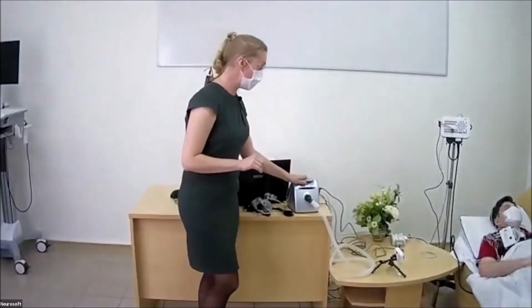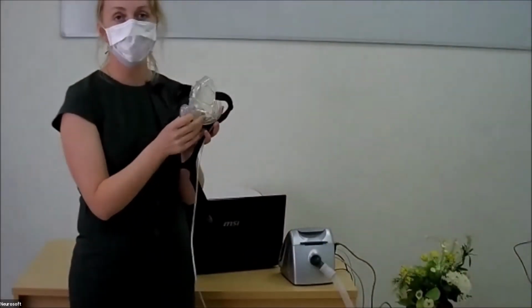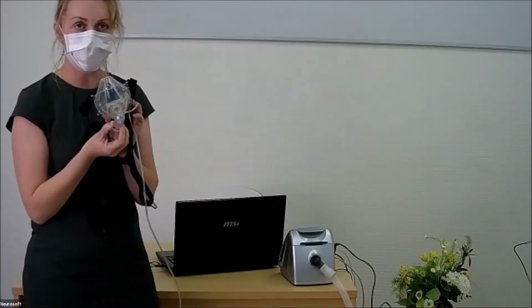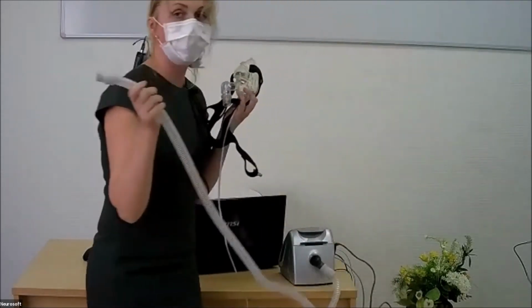And to perform this therapy, we need a PAP device, and the PAP system consists of several components. This is the PAP device. This is the mask which we put on the patient's face, and there are different types of masks, and this is a full face mask, and we connect this mask to our unit with the help of this flexible hose.